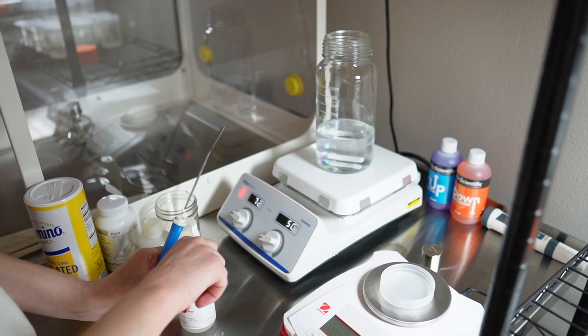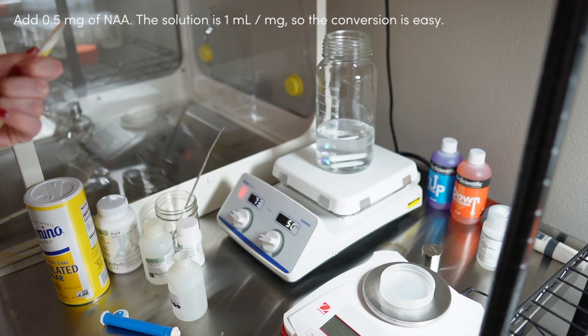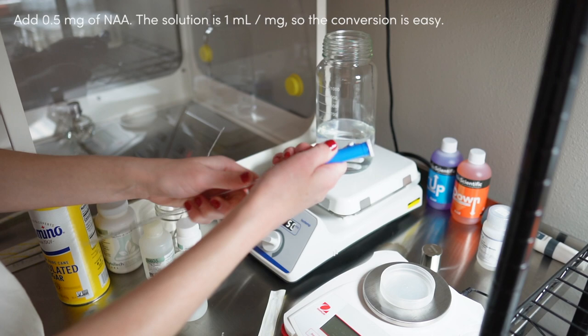The first thing that you saw me do was add 400 milliliters of distilled water to the glass container, and the second thing was just adding half a milliliter of plant preservative mixture, or PPM, which just helps reduce the contamination potential.